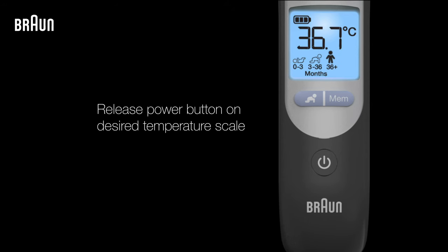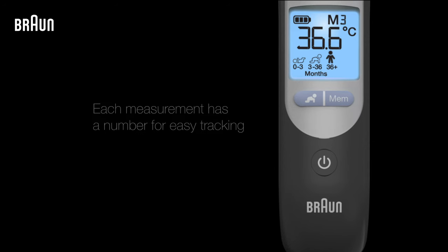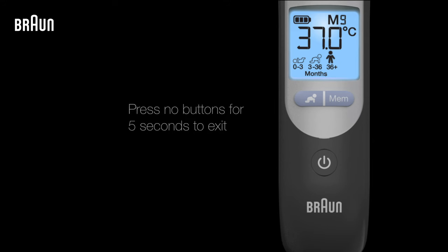A short beep will confirm the new setting. You can also access the last nine temperatures that were measured by your thermometer by pressing the MEM button. Each stored measurement will be displayed with a number to help you easily keep track of them. The thermometer will automatically exit memory mode when no buttons have been pressed for five seconds.